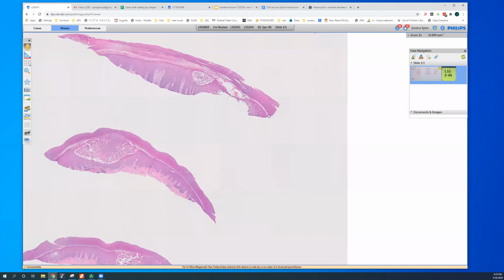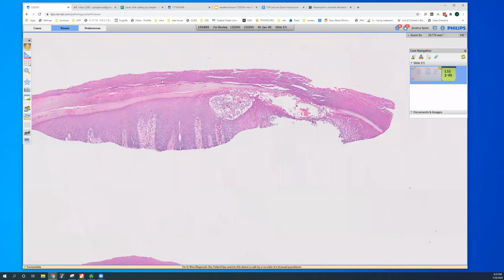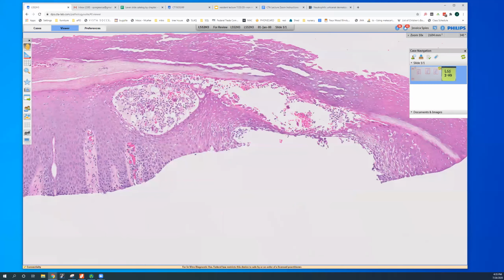And we can see, actually, this is an acral site. This is acral type stratum corneum. And you can see at low power, the normal stratum corneum is being lifted off by this thick parakeratotic layer. And actually, in this particular example, there is some serum. So occasionally you can get serum.